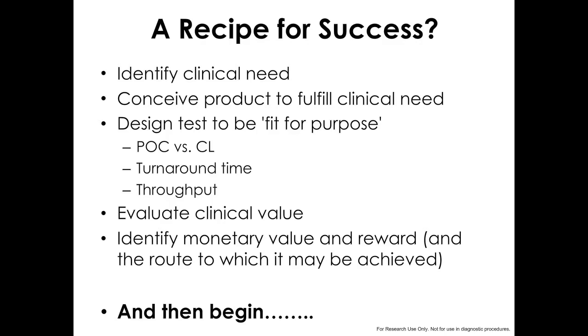In our case, once the product was in for patients with prostate cancer, that defined the required throughput and the speed with which the test needed to be performed. And that really does then revolve around designing the test to be fit for purpose. Whether it's going to be point of care or it's undertaken in a clinical laboratory, it'll define the turnaround time and the throughput required. And then we need to undertake a process of evaluating the true clinical value of the test that we think we've developed. And in our case, that's something that's very much ongoing.